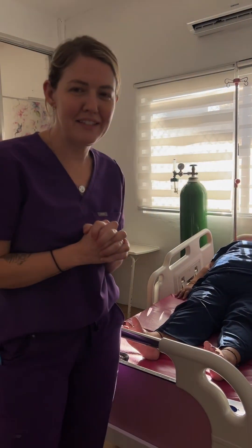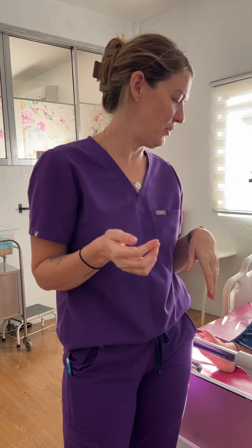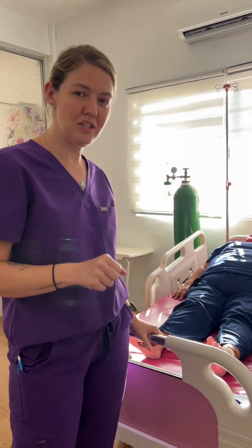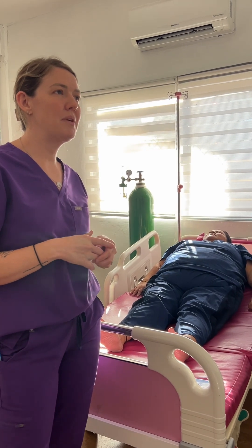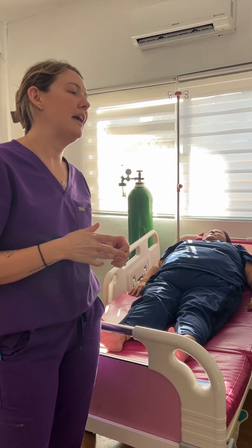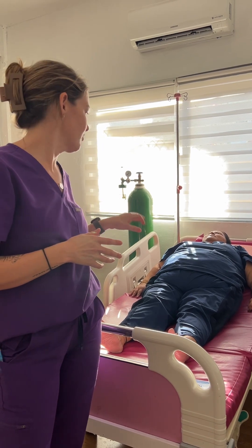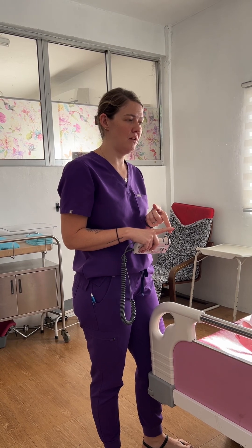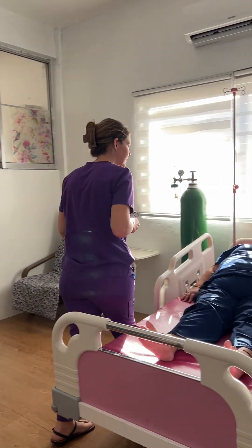I'm going to be acting out abnormal fetal heart tones in labor and what to do during that situation. This is Rona, my patient. She is a G2P1, she's been in active labor for about an hour, and she's laying flat on her back right now. Her membranes have been ruptured for 30 minutes, and on internal exam she was seven centimeters. Is it okay if I listen to her tones?